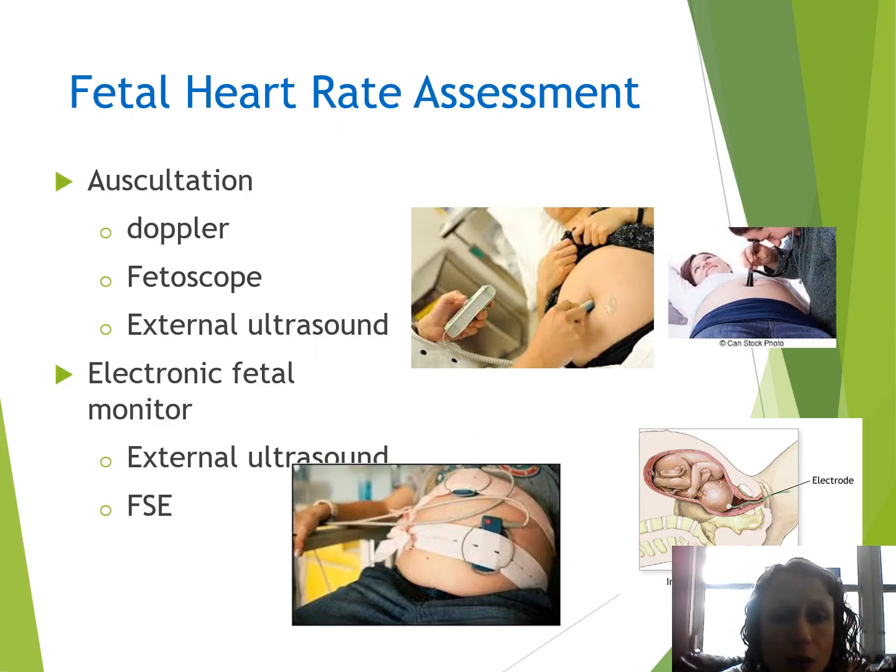Okay, so this goes back over the methods we could use for a fetal heart rate assessment. We might use a Doppler, a little handheld machine that lets us hear the baby's heart rate. You probably aren't going to see a fetoscope anytime soon, but that's the little stethoscope they put on the head that's super interesting looking. Then there's the external ultrasound, and of course our internal fetal scalp electrode. And we also have wireless monitoring, right?